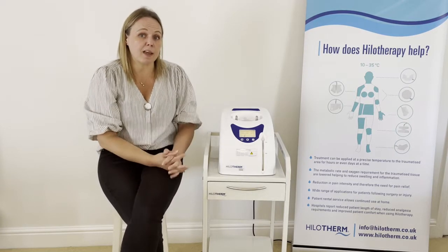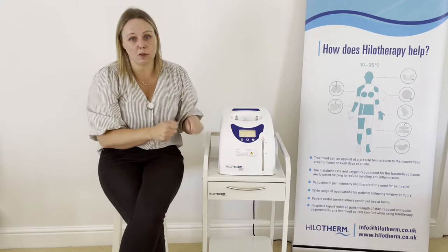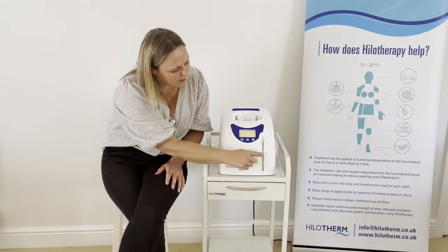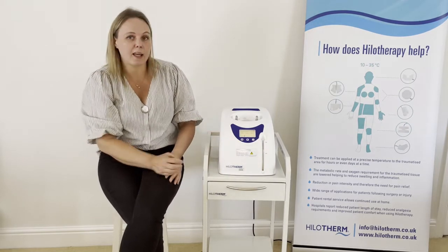Anything above 23 degrees C can start to impact how the device cools, particularly if you are targeting the lowest temperatures such as 12–13 degrees. On the front of the machine there is a water level indicator with a minimum level and a maximum level.